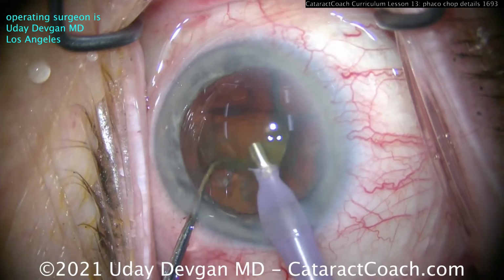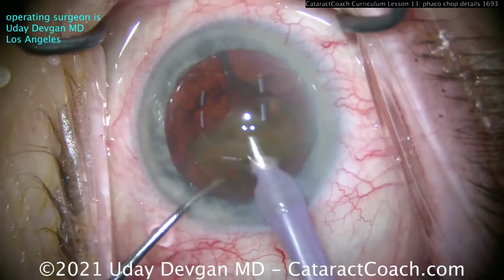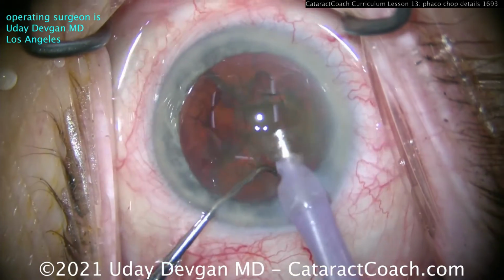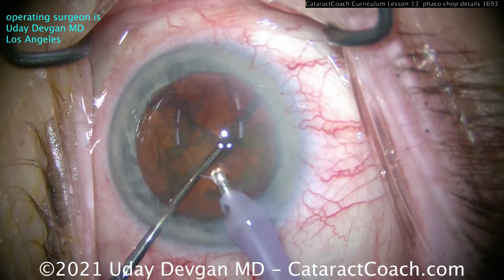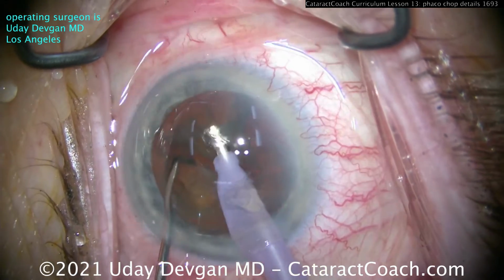Traditional horizontal chop requires you to place the chopper under the capsulorhexis and go out to the equator of the capsular bag so you can hook the lens equator. Vertical chop keeps both instruments right there in the center and changes the force vector to a more vertical one. This is a combo chop. It's kind of a little bit of both. Let's call it the best of both worlds here.